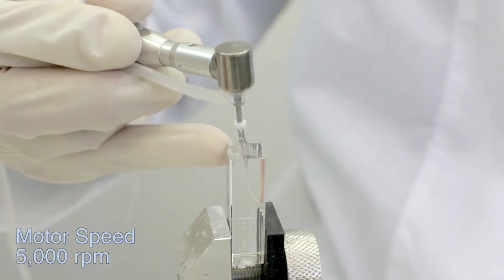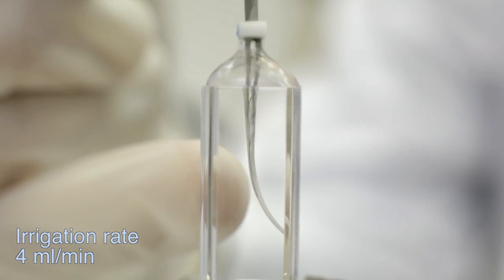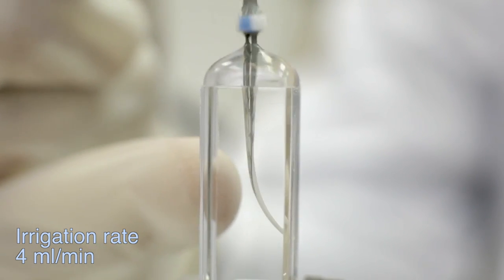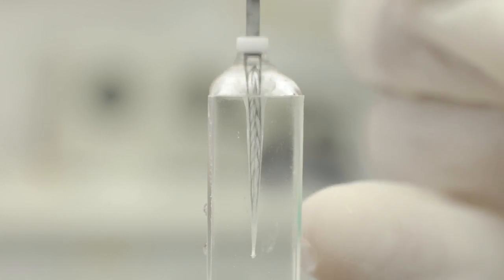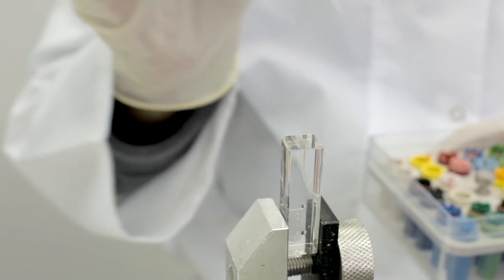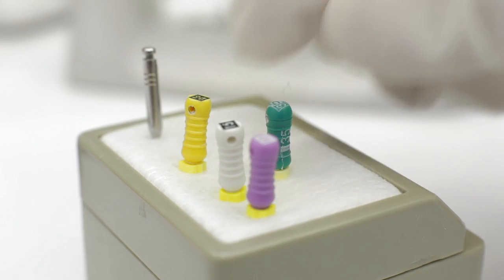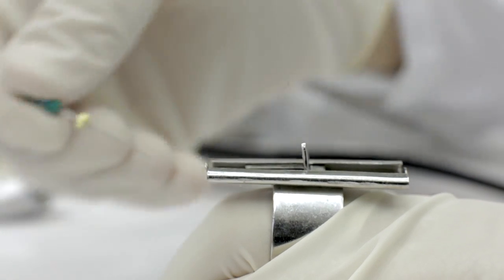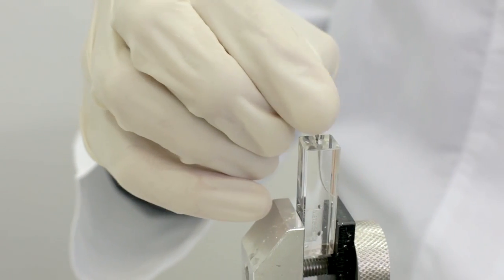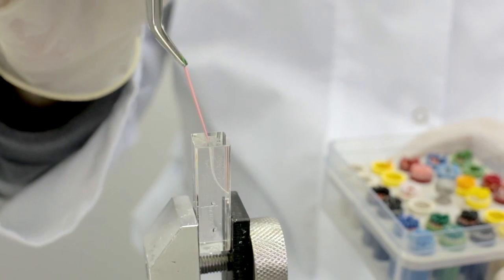Treat each canal using light pecking motions for 4 minutes with a recommended irrigant flow rate of 4 milliliters per minute. When used properly, the file rotates to change its axial position only during the outbound stage of the pecking motion. Prior to obturation, gauge the prepared canal using gutta-percha master cones or 9Ti hand files to determine final canal dimensions. Final canal dimensions are expected to be 2-3 ISO sizes larger than the initial apical size. More information regarding obturation after SAF preparation can be found in the SAF System Clinical Guidelines Manual.